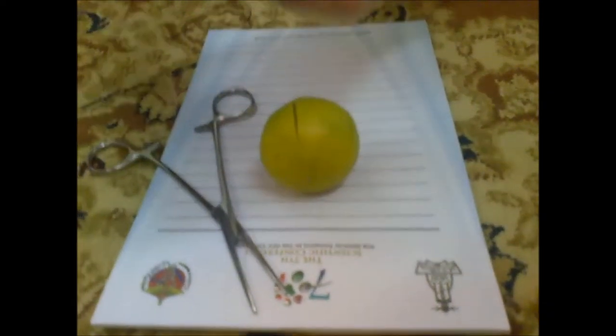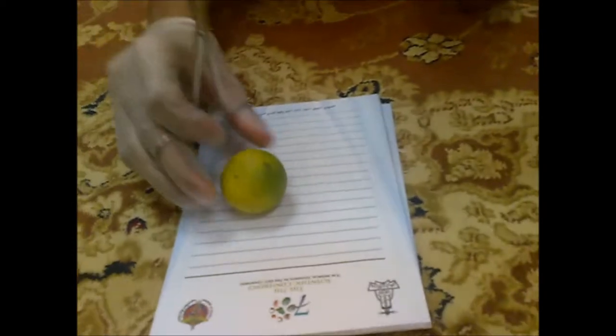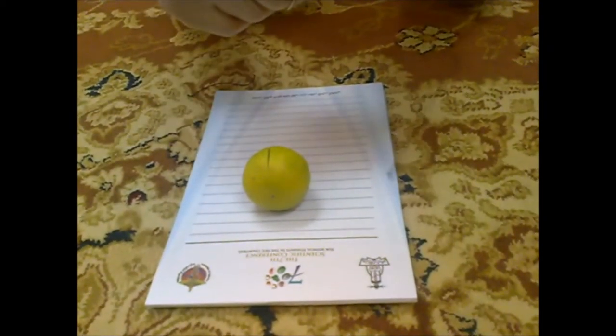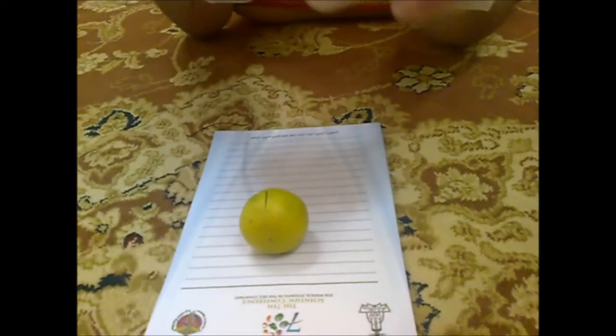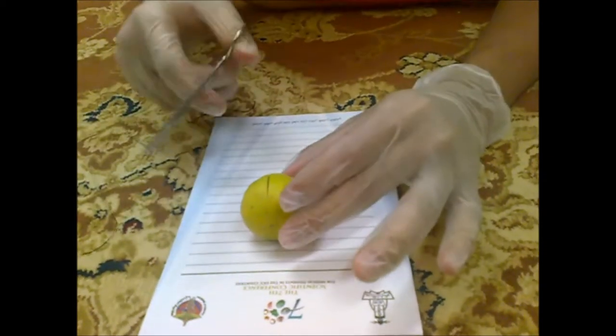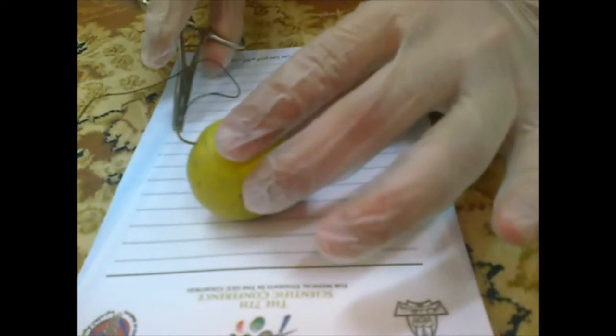Let's start stitching. You have to ask your patient to be stable, not to move. First of all you have to insert the needle in the skin, perpendicular to the wound.